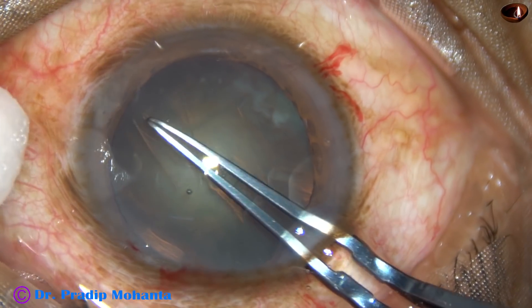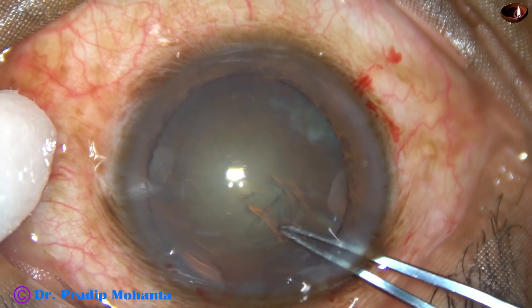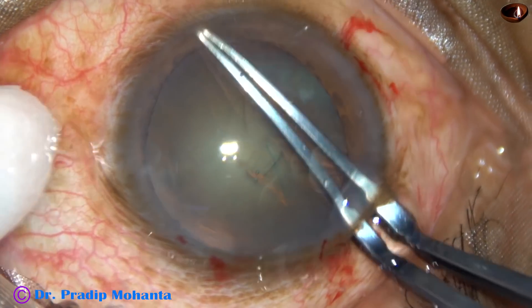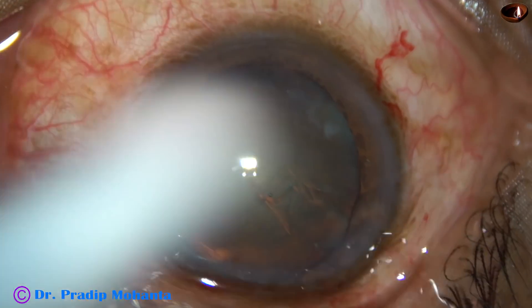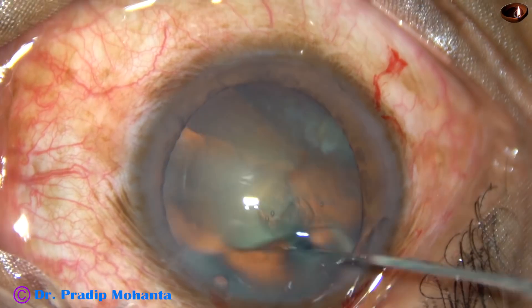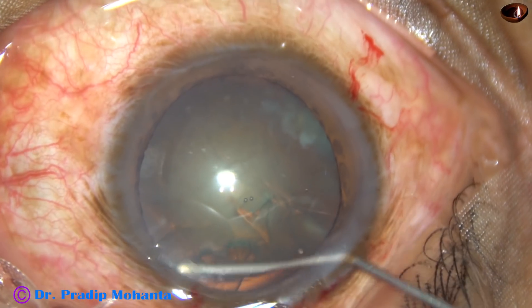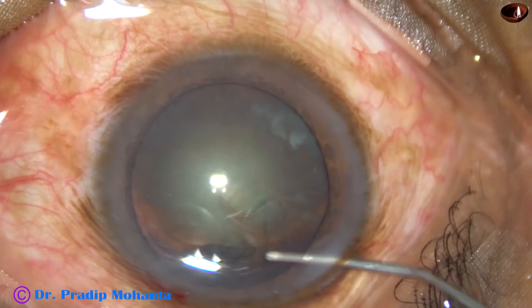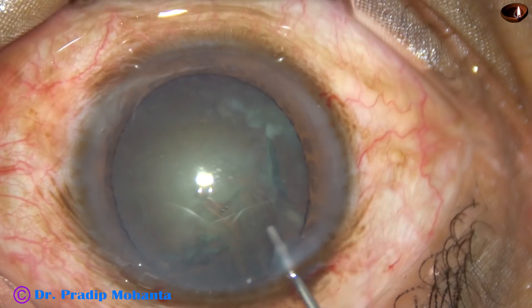Capsulorhexis is being done at this moment. This nucleus is not as soft as the previous one — nucleus sclerosis in this case is grade 2 or grade 2 plus. Let us see if we can chop this nucleus with the hydro cannula itself.